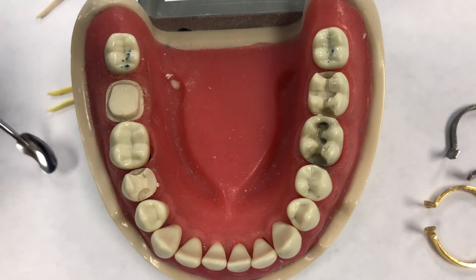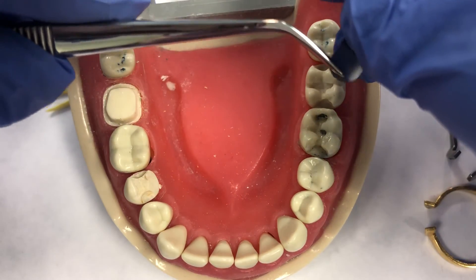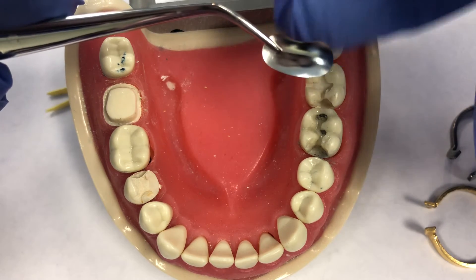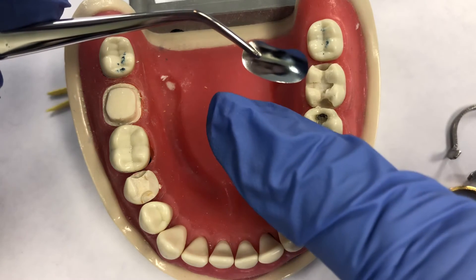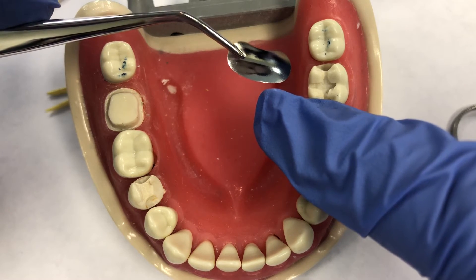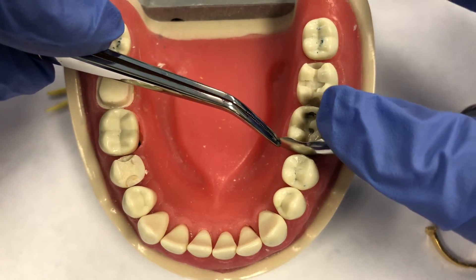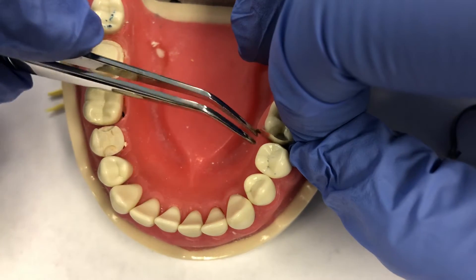I'm going to pick up the matrix with my cotton pliers. When you look at the matrix, it looks like a little kidney bean shape. It is pre-contoured — if you notice, it has this curve to it. That curve will hug the tooth. The divot at the top corresponds to the occlusal surface of the tooth, and the bump on the bottom curves outward and goes into the sulcus. So I'm going to turn this around so the contour will go against the tooth, and I'm going to floss this into position, kind of seesaw back and forth into the sulcus.